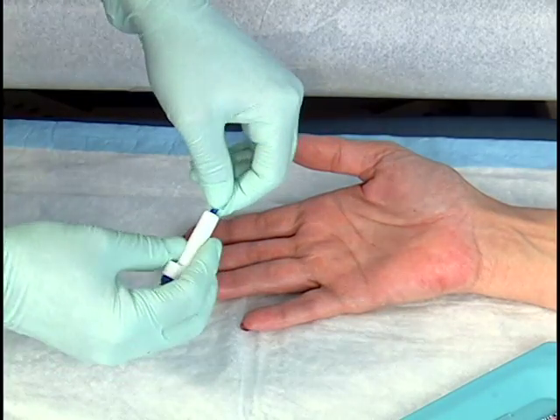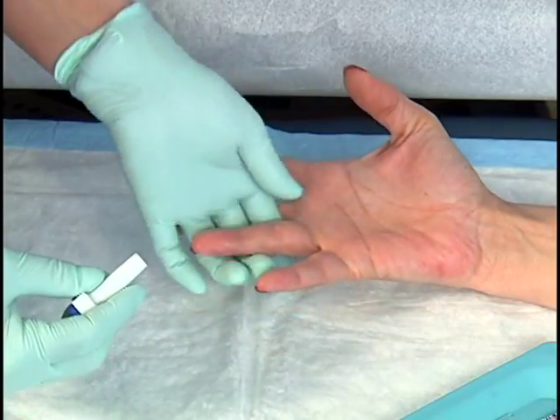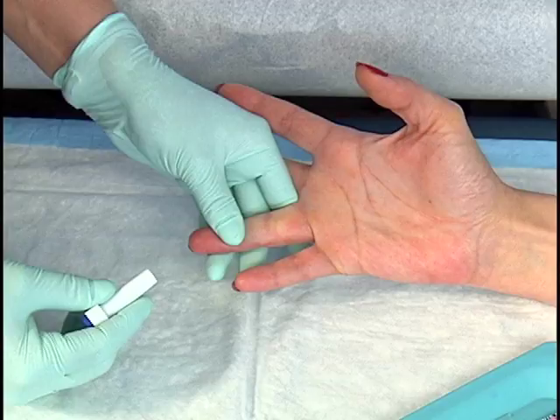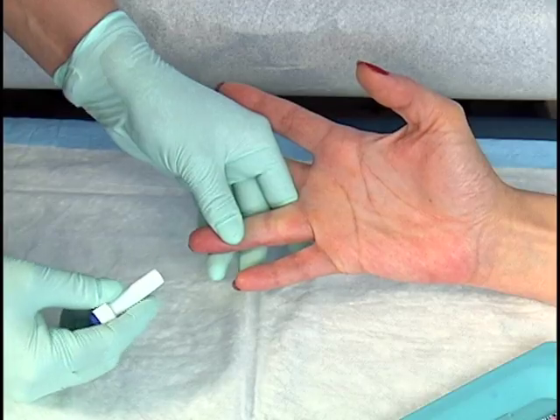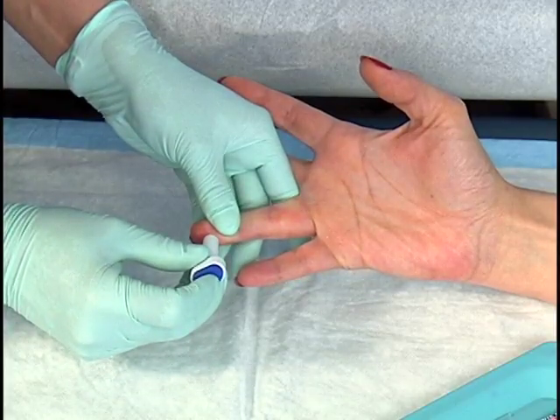Firmly grasp the patient's finger in front of the most distal knuckle joint. Apply enough pressure to cause the fingertip to become hard and red. This ensures that adequate penetration and depth of puncture will occur. Position the blade of the Lancet perpendicular to the lines of the fingerprint on the fleshy portion of the fingertip and slightly to the side of center.